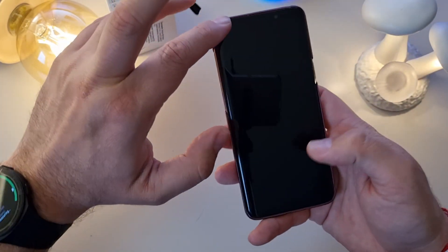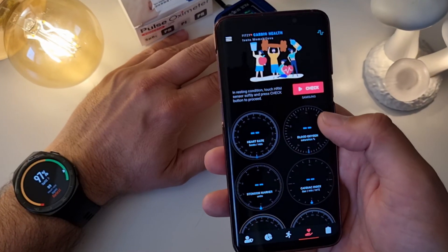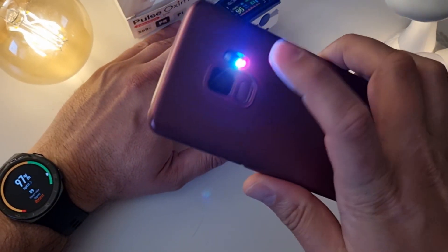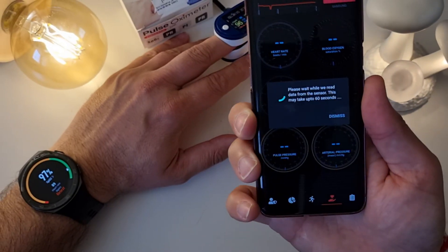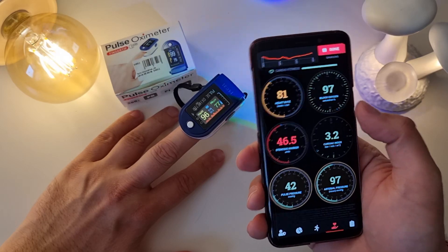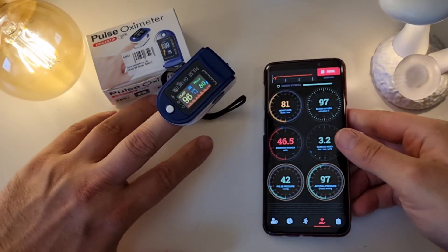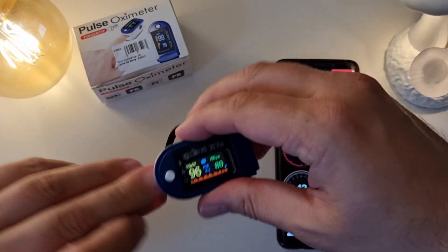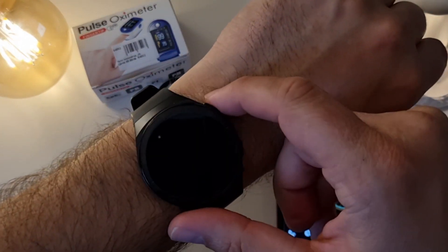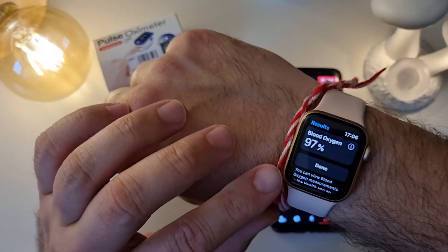The last measurement is going to be with the Samsung Galaxy S9. I press 'check' and place my finger on the sensors. The result is 97 percent on the S9. The pulse oximeter reads 96, the Huawei watch shows 97, and the Apple Watch 6s also reads 97.